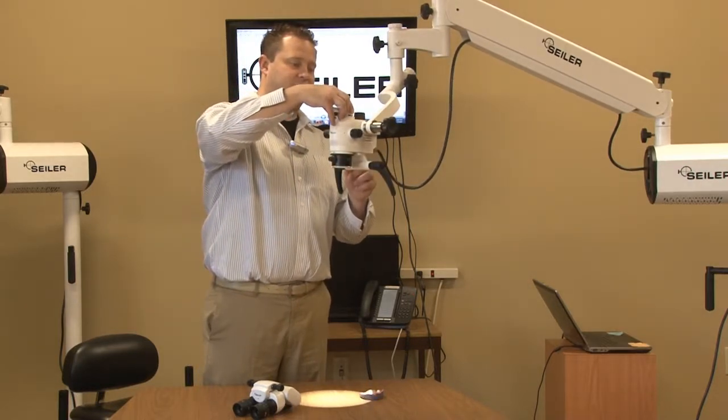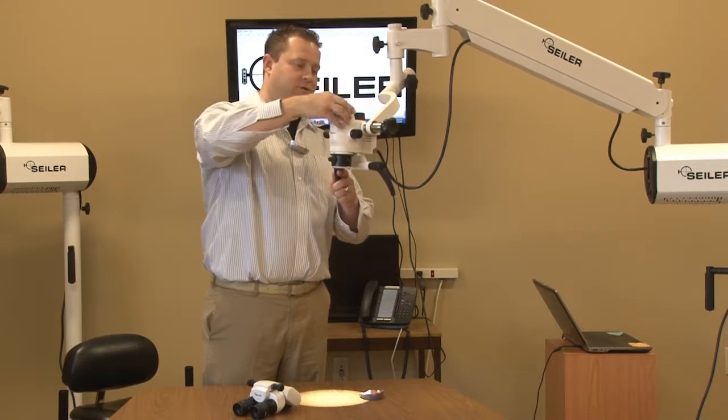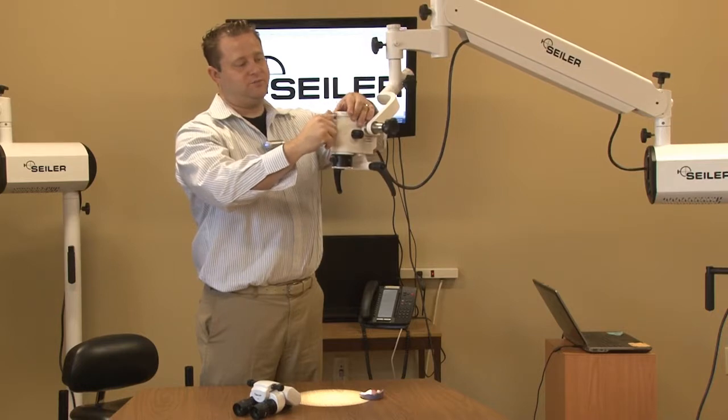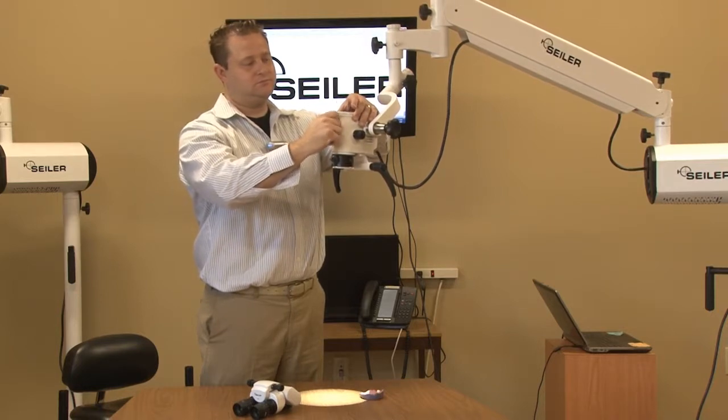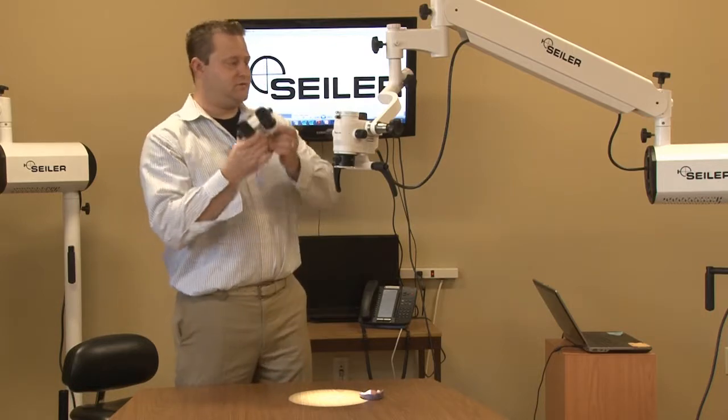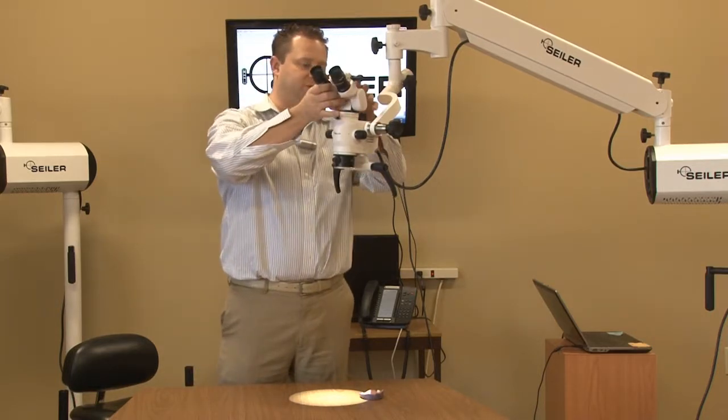It just slides directly on and locks in place. Now we're going to put the binocular head on top of the laser filter.